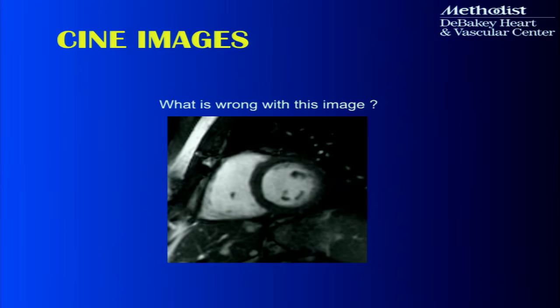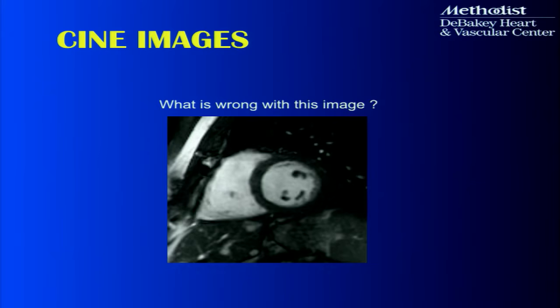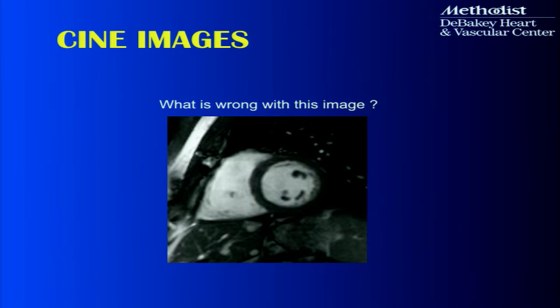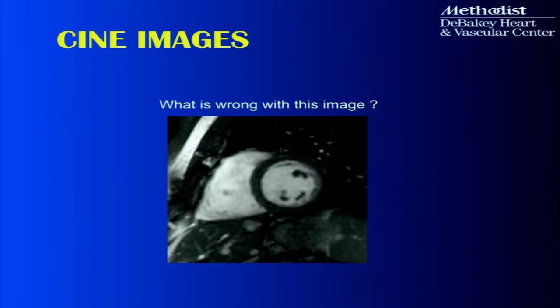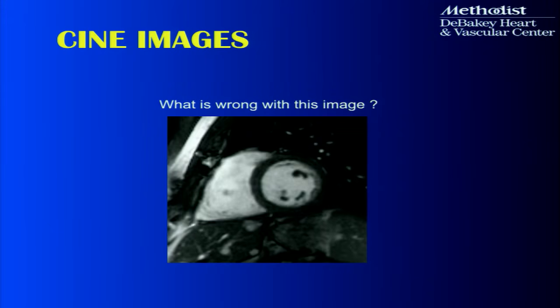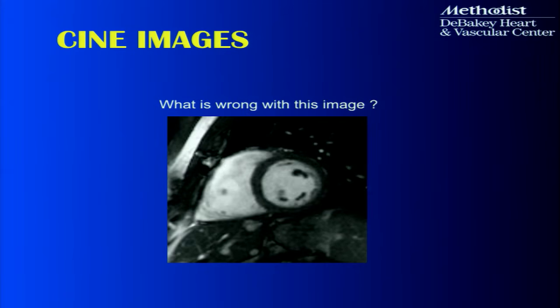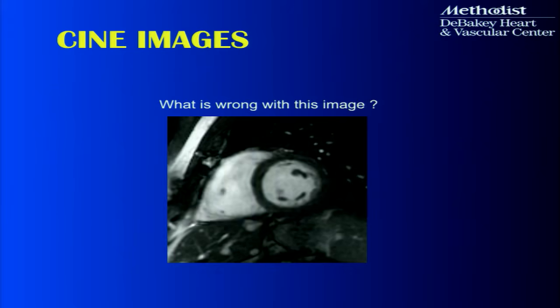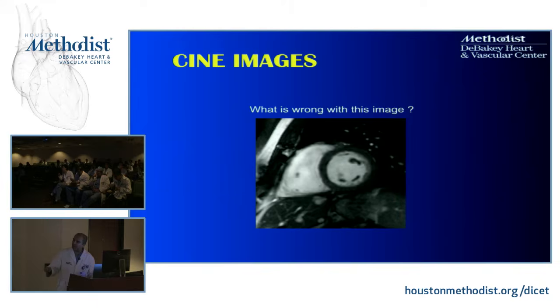So describe what it looks like. Somebody said it's missing systole. Now, if you look at it, you see all of systole here, right? But then it's missing the second systole, right? So what's happened here is, in fact, it's not that I'm missing systole, it's that I've actually acquired too long of a period of time. So I've acquired one full cardiac cycle, and I start to acquire part of a second cycle, and then I stop, right? Does everybody appreciate that?